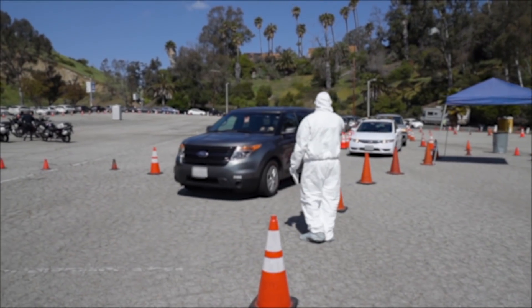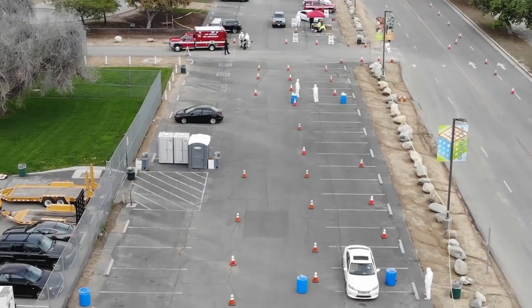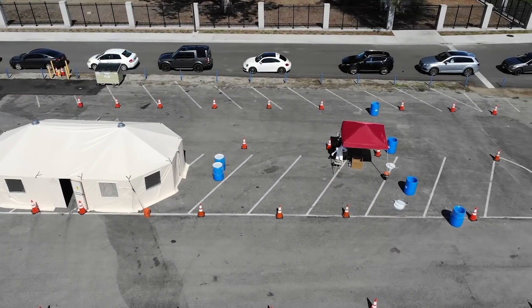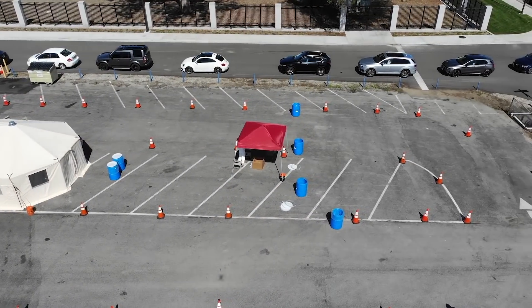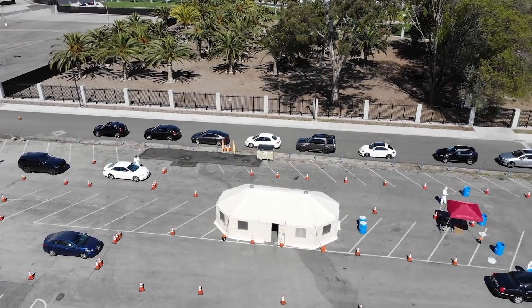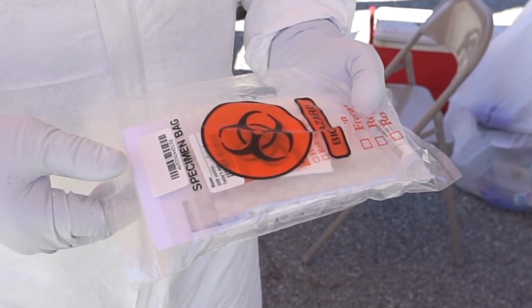The current method of COVID-19 testing involves a self-collected specimen that will then be securely transported to the lab. In order to practice six-foot social distancing at all times, this video will guide you through the step-by-step process of collecting your sample and packaging it for delivery.